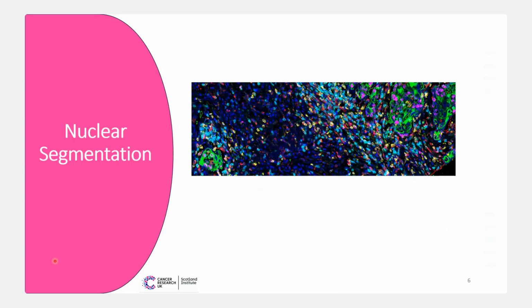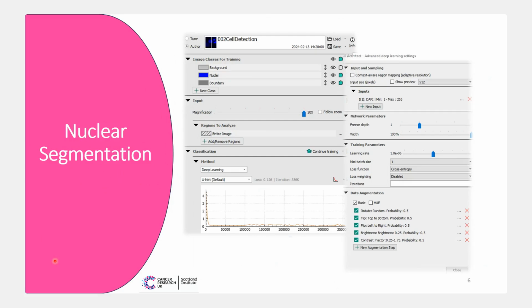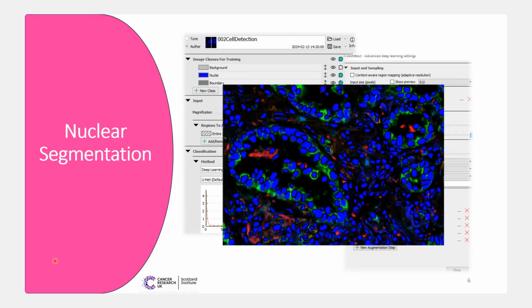Once we segmented our tissue into regions, we then go into nuclear segmentation, and we use the app that Visiopharm developed, and we have retrained on a lot of our lung adenocarcinoma cohort. This is due to our low DAPI staining in this tissue. And again, we'll get our pathologist just to make sure and validate that everything's okay. So you can see here that it actually works quite well. It's worked better than we've seen in QPath, etc. So yeah, we're quite happy with it.